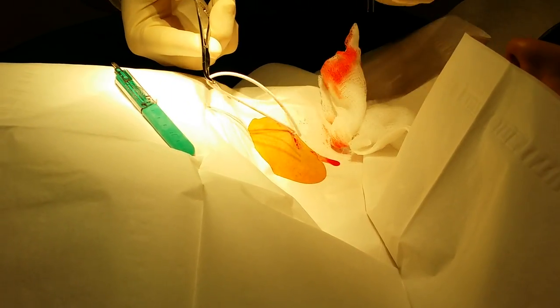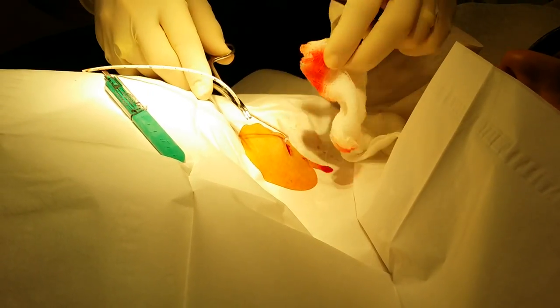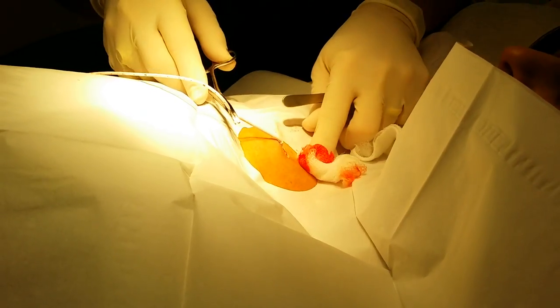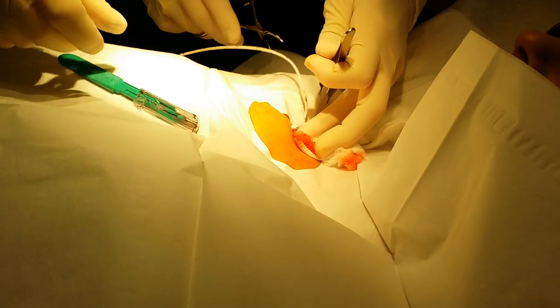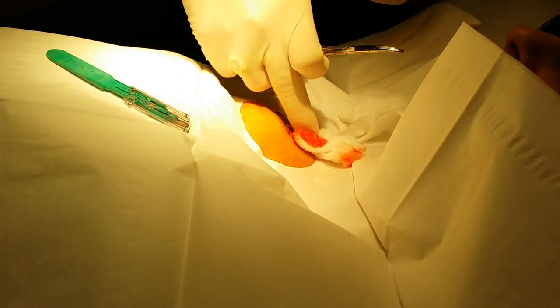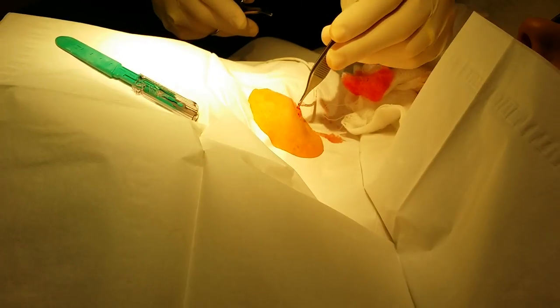Wow, the tube — you can see the tip! Oh my gosh, that was in your vein. So my vein's not just going to start oozing right now? No — sometimes there's a little bleeding in there, but it usually closes off pretty quickly. The vein is a low-pressure system, so when you pull it out, the tissue just kind of collapses down, and there's really not much bleeding at all.